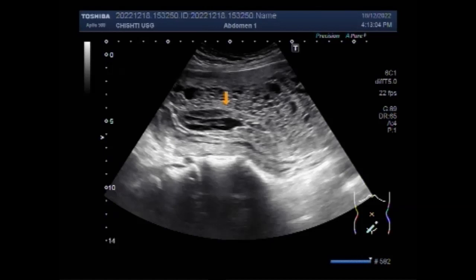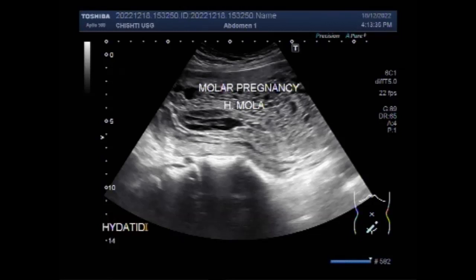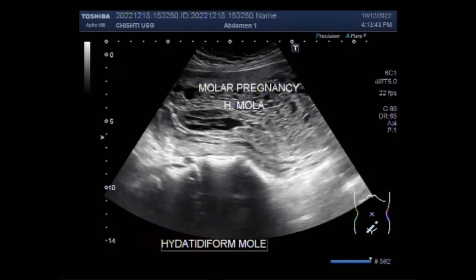Hydatidiform mole is a common complication of pregnancy. It consists of a non-viable embryo which implants and proliferates within the uterus. A hydatidiform mole can either be complete or partial. The presence or absence of the fetus or embryo is used to distinguish the complete from the partial moles. Complete moles are associated with the absence of a fetus — as you can see in this case, there is no fetal or embryo seen in the uterus.